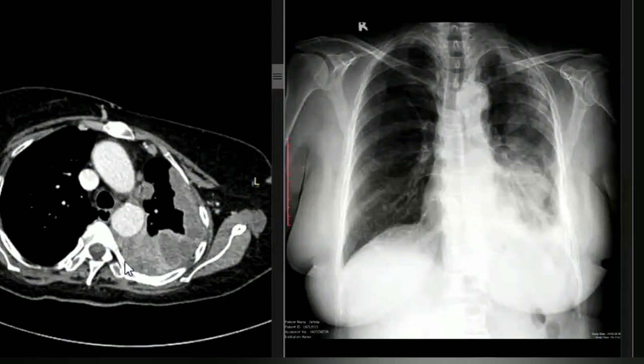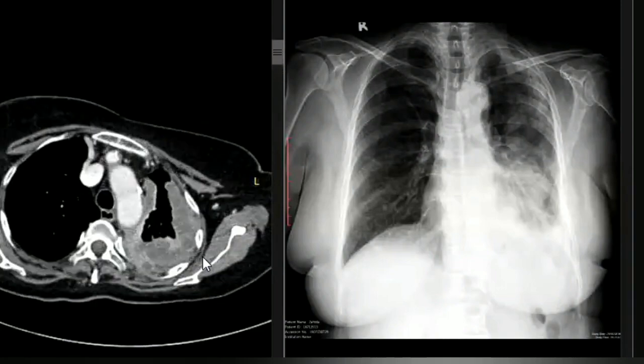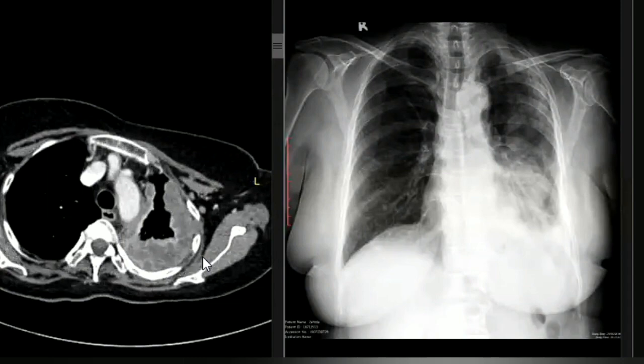Ma'am, it is mesothelioma, but I cannot... So would it be mesothelioma or metastatic disease, right? Yes. And obviously biopsy is needed, but tuberculosis will not be a differential, because the hallmark features of tuberculosis, if you say acute, are the consolidations and then pleural effusions, and if it is acute on chronic, then fibrosis.